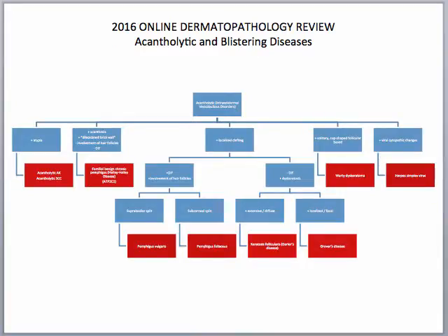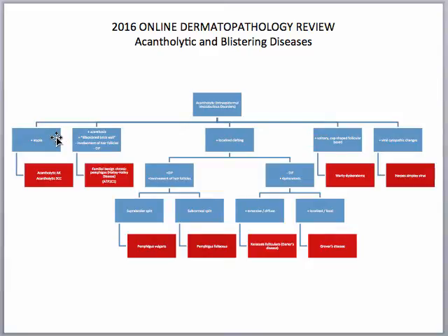Starting out, whenever you get a case you want to look at it from low power to establish what type of pattern you're seeing. If you see an acantholytic pattern — meaning there is separation within the epidermis — then you want to take a look at medium and high power view to see if there are any other distinguishing features.